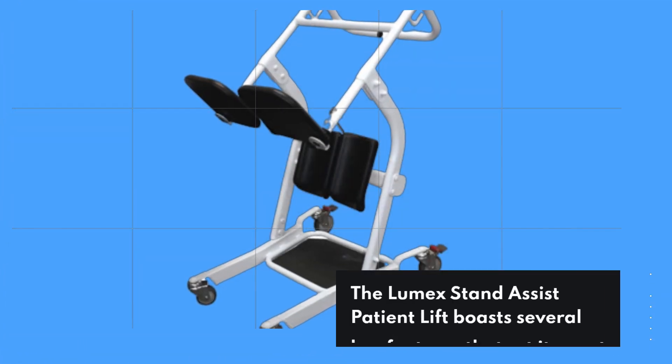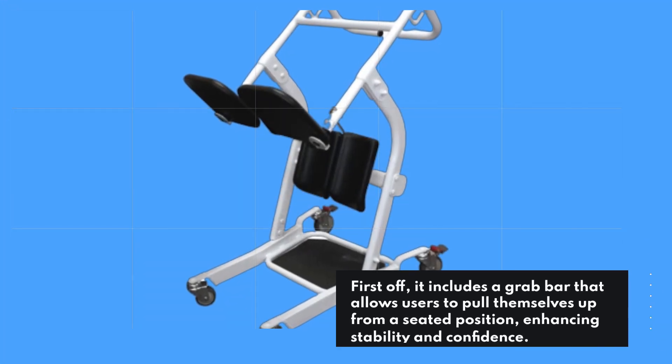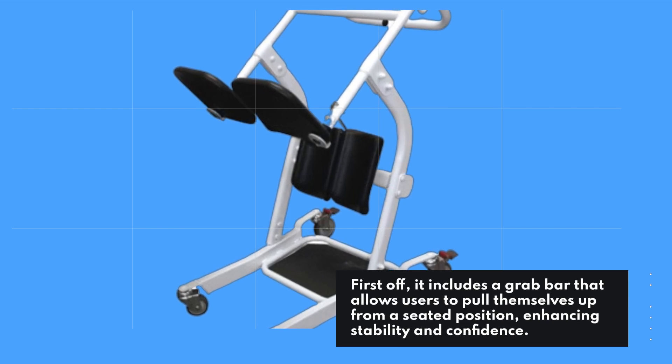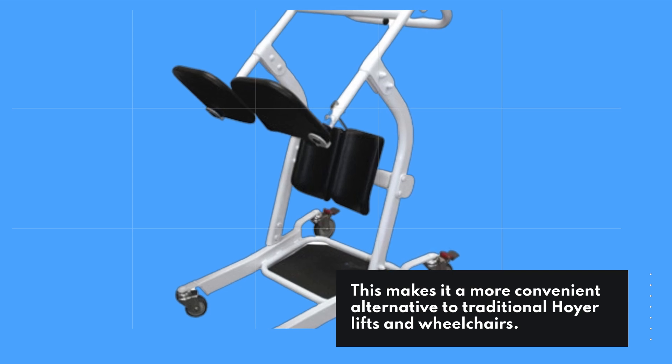The Lumex Stand Assist Patient Lift boasts several key features that set it apart. First off, it includes a grab bar that allows users to pull themselves up from a seated position, enhancing stability and confidence. This makes it a more convenient alternative to traditional Hoyer lifts and wheelchairs.